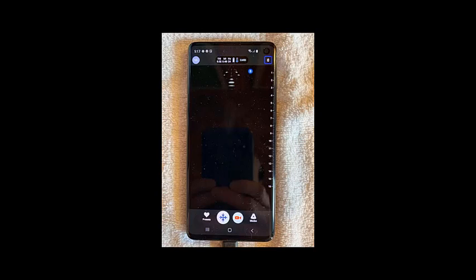If you select the cardiac preset, the machine is going to default to echocardiography orientation. That means that the indicator will go from screen left to screen right. All you need to do to change it back to clinical orientation, which is what the vast majority of us use, you'll tap the B right there and it'll toggle over to the other side of the screen.